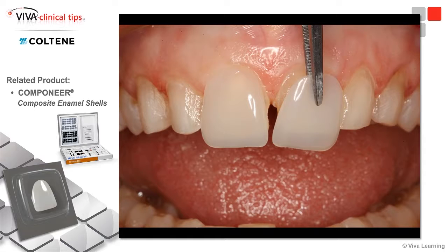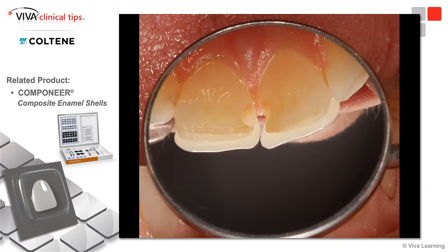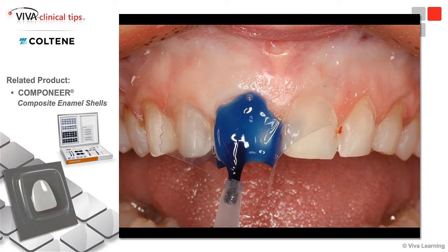Once you do that, they fit intimately, and here we're going to bond them directly to the tooth. But you have to use a restorative composite, specifically designed to use with Synergy D6, to build the internal surface so that it does fit intimately. So at this point, we're going to acid etch the tooth that we're going to place. I like to place these really one at a time.